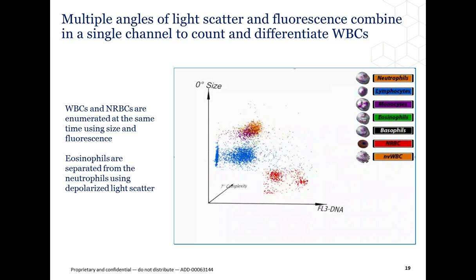The optical and fluorescence data of the unclassified cells, as you see accumulating on the right-hand side of the graphic, form the records, the 5 pieces of optical and fluorescence data that we will use to classify those cells. These broadly equate to cellular size, complexity, lobularity, granularity, and DNA staining. Once the data is collected to 20,000 events, the software algorithms take over and begin classifying these cellular events.